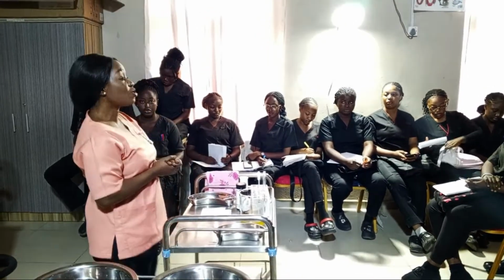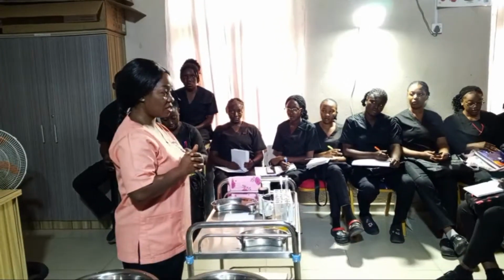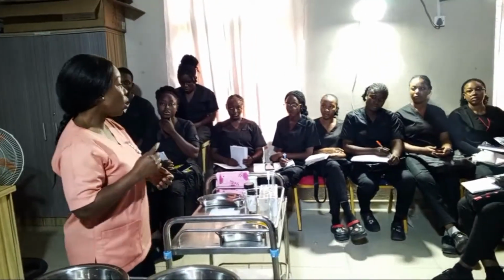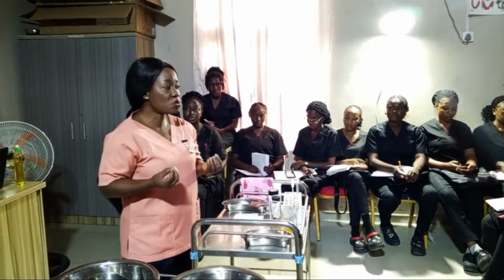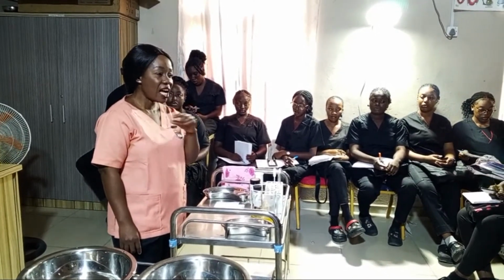The first thing you are going to do as a nurse when you are going to carry out this procedure, sometimes the question will say, carry out glucose tests on this patient or the specimens before you, or carry out protein, depending on the question, right? So the first thing you will do is to look at the instruction. That is the first step for you to pass that particular exam. Take your time. Take some seconds. You can even take 30 seconds to do that.